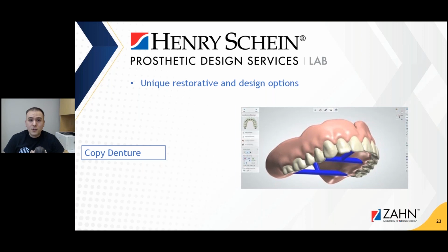So the copy denture is really, if you work with a design center that supports that workflow like they do, you basically reline the denture, or you can do a pickup so you can get the intaglio surface. That denture gets scanned, split into 2 files, redesigned so that it's produced with the latest and greatest material in 3D printing. And basically, the patient gets a great fitting denture that looks just like the old thing.